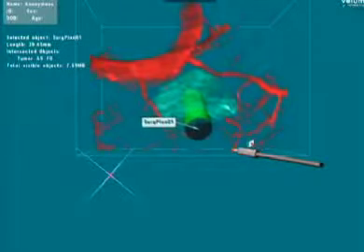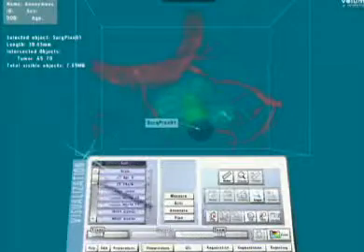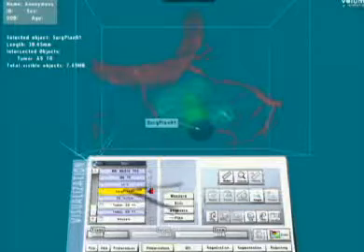Here we had our preoperative surgical plan. As part of our surgical task in this particular instance, we definitely wanted to avoid the vein of Labbé. This patient had a significant vein of Labbé going just anterior to the tumor. There was also another vein that we wanted to avoid in the posterior margin of the tumor.